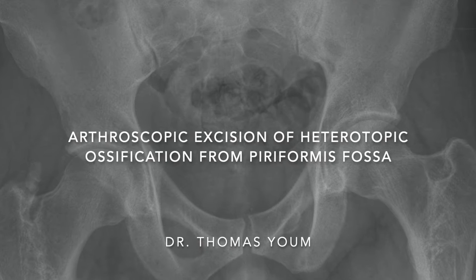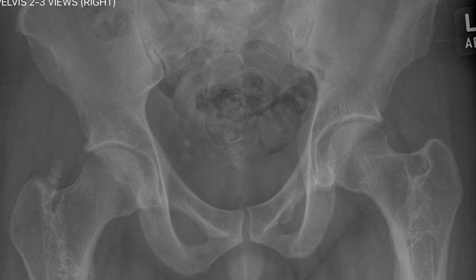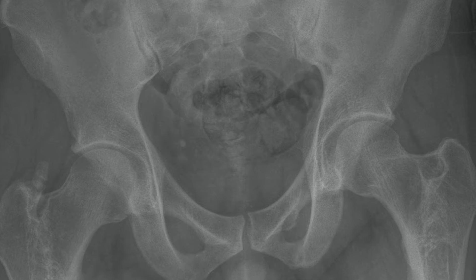Arthroscopic excision of heterotopic ossification from the piriformis fossa. Many of us have encountered HO after hip arthroscopy and have excised HO from the anterior capsule and rectus femoris, where it is commonly found.